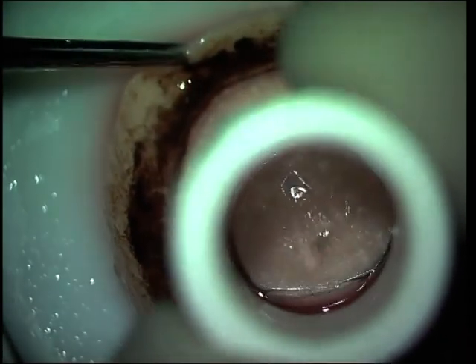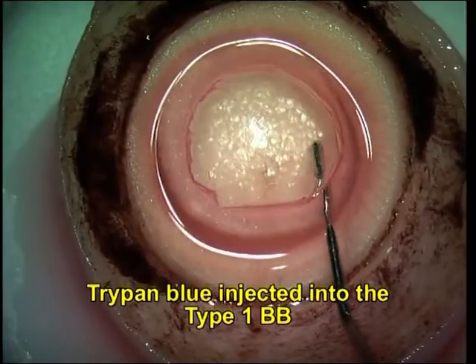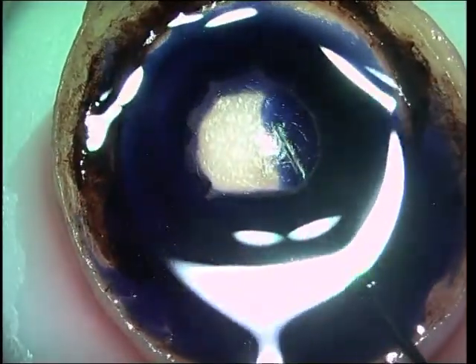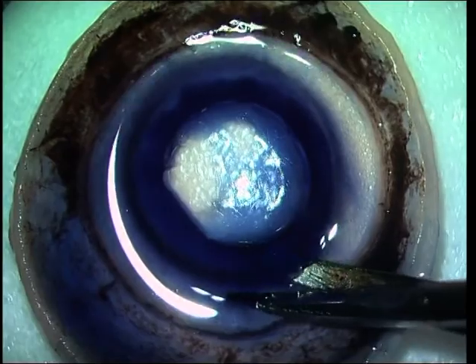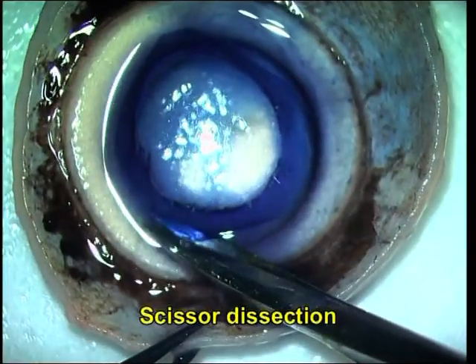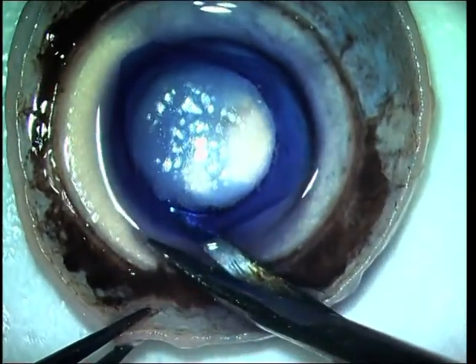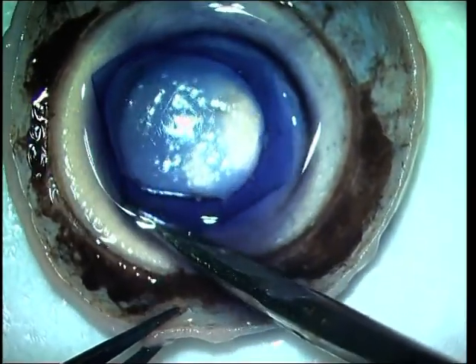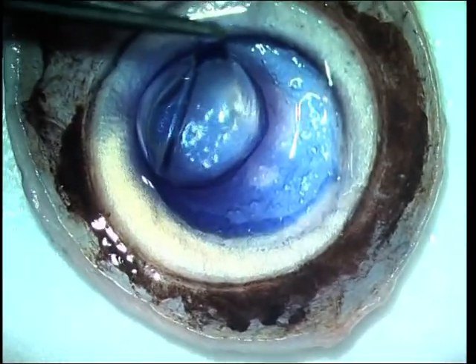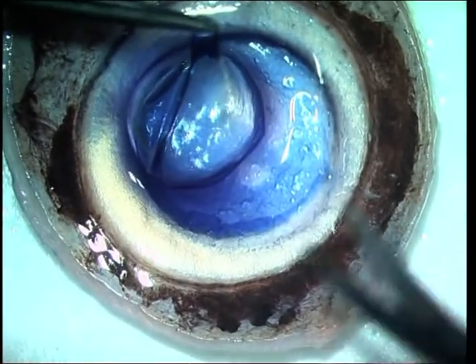An 8 mm trephination is done. Trypan blue is used to stain the Descemet's membrane. Knife entry is made to allow scissors to dissect the donor button in toto without tearing it. Retaining the pre-Descemet's or Dua's layer allows complete dissection due to the added thickness to the graft.